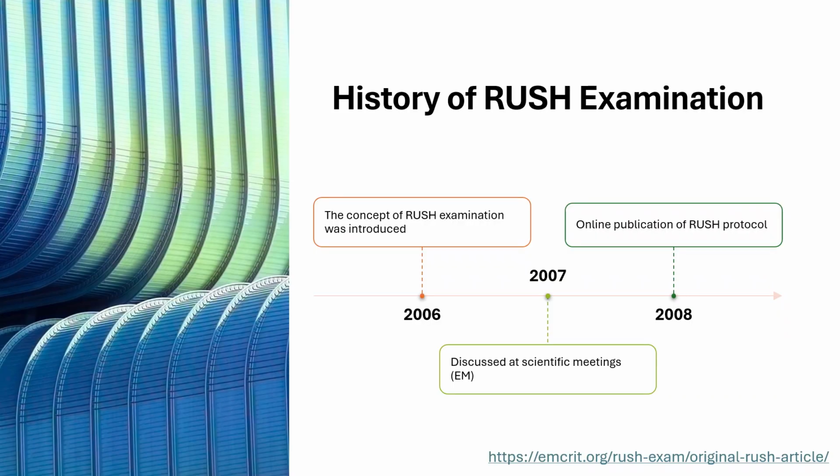Let's review the history of the RUSH examination. It was first introduced in 2006 as a concept. One year later, it was discussed at national scientific meetings, mostly emergency medicine, and in 2008, an online protocol was published. It is important to give credit to emergency medicine colleagues who pioneered this practical point-of-care ultrasound assessment.